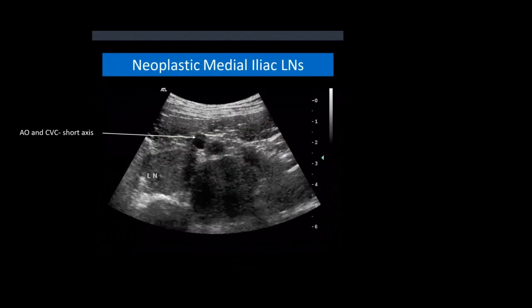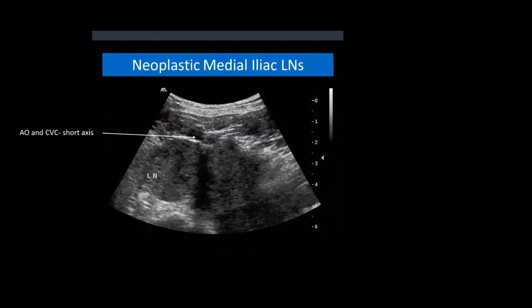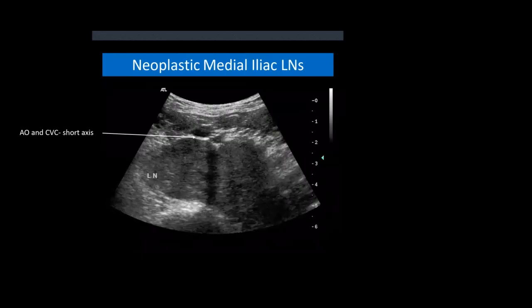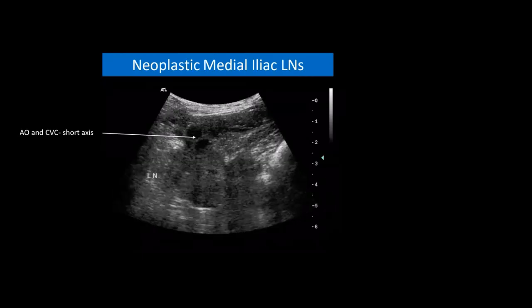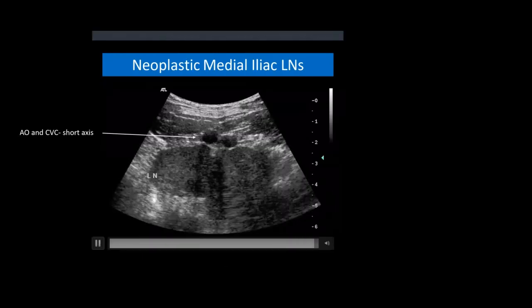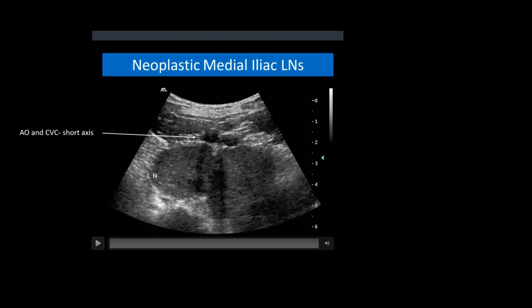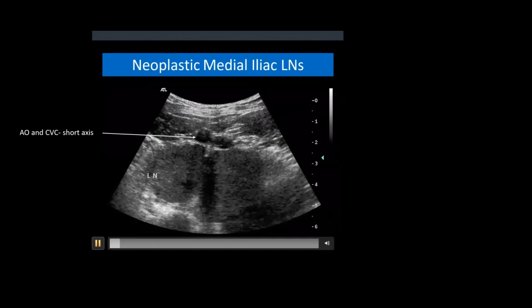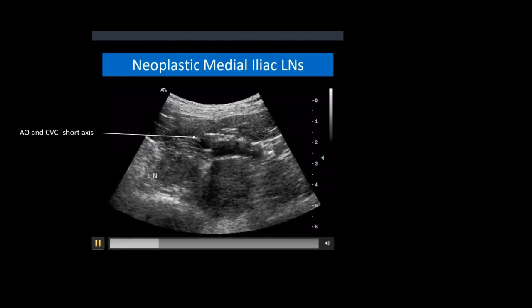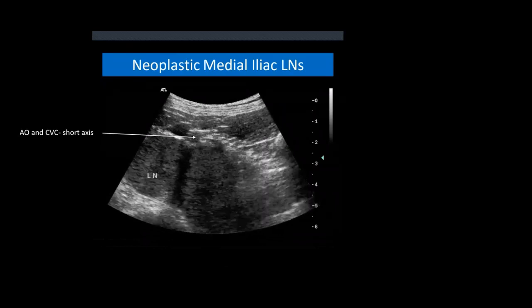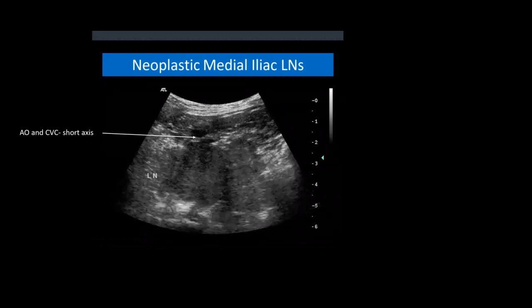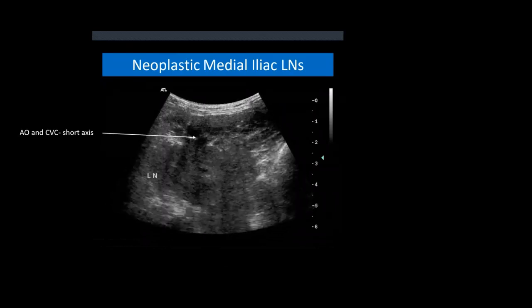On the next slide we have a short axis view through the medial iliac lymph nodes. Just to get your landmarks: we have the aorta, the caudal vena cava, and these golf ball-like, hypoechoic structures are the neoplastic medial iliac lymph nodes. This is a German Shepherd that had an anal mass and had these huge neoplastic lymph nodes.